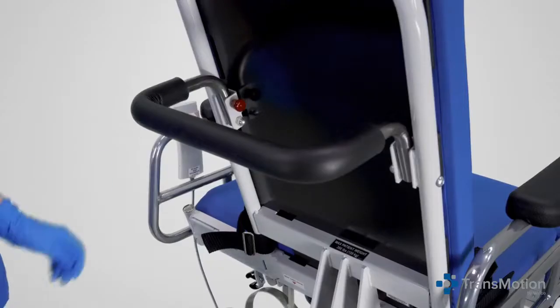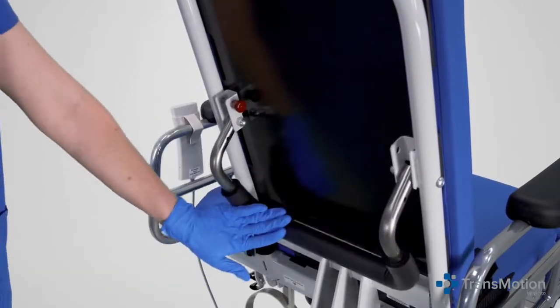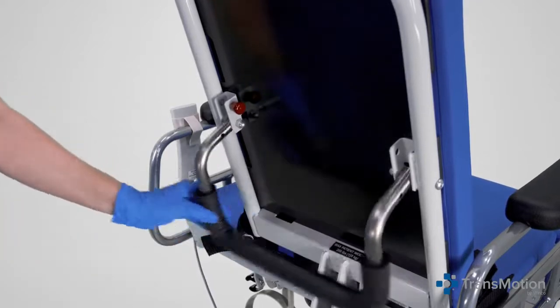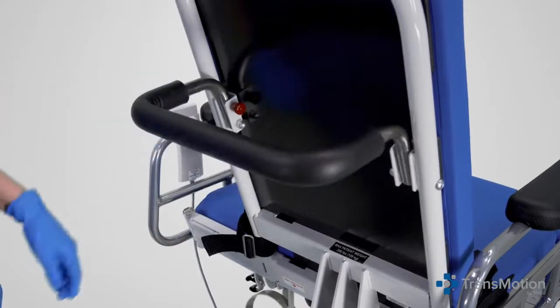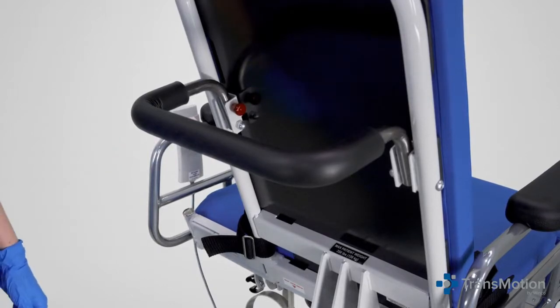To lower the push bar, grasp the push bar tube while pulling out on the red release knob, then lower the push bar into the down position. To raise and lock the push bar, lift up on the push bar tube until it's in the up position. The locking knob will engage automatically.